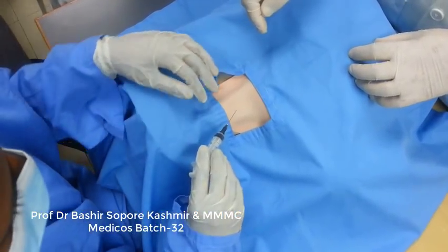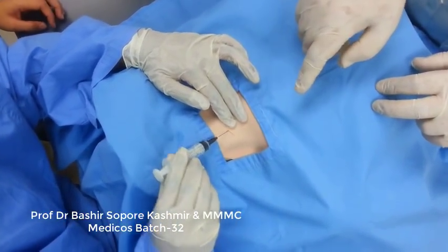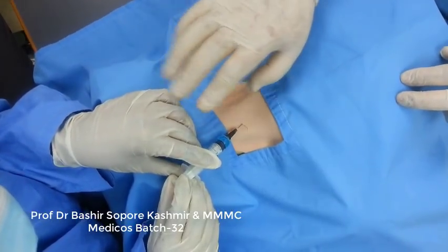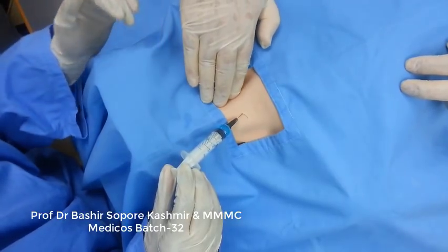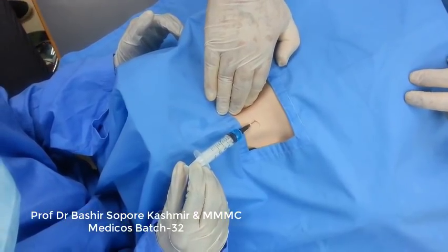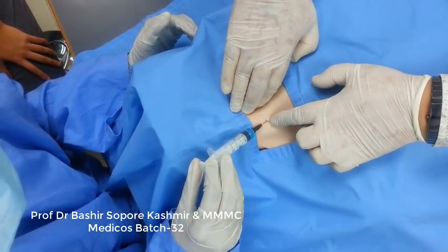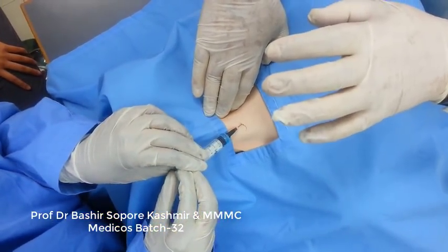So we will try to find the vein. You have to go very superficial, and the direction should be ipsilateral. Before introducing the needle, you have to first palpate the carotid artery like this. When you find the carotid artery, then lateral to the carotid artery you will insert the needle. The needle is to be inserted at 45 degrees, not too deep, only superficial, up to 2 centimeters.